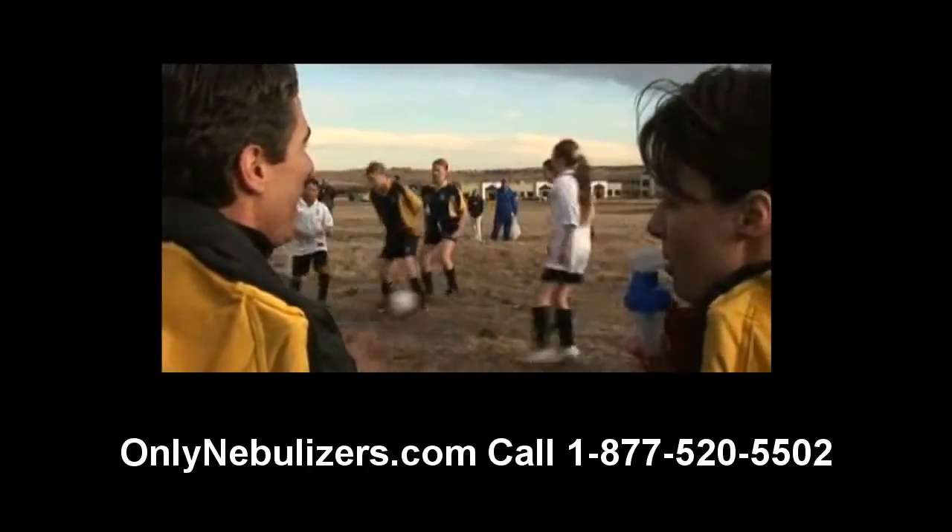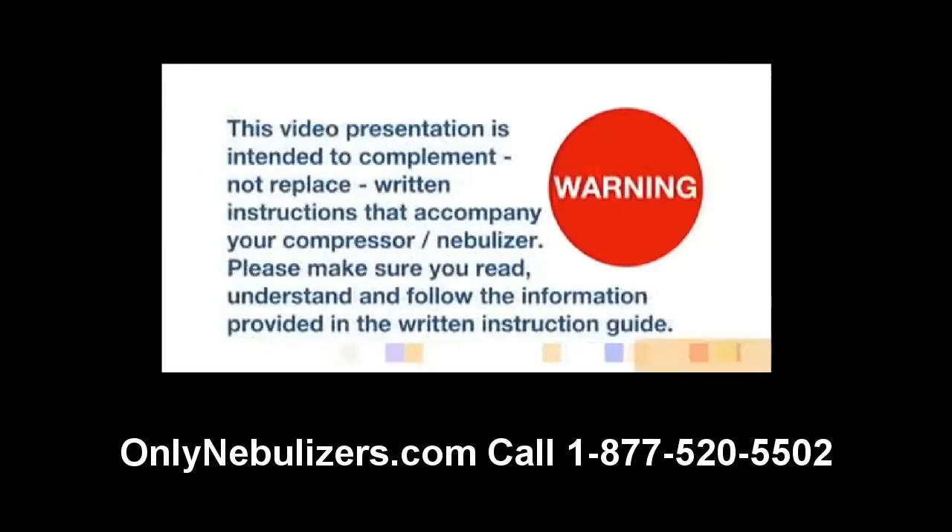For the treatment of asthma, COPD, and other respiratory ailments. This video presentation is intended to complement, not replace, written instructions that accompany your compressor nebulizer. Please make sure you read, understand, and follow the information provided in the written instruction guide.